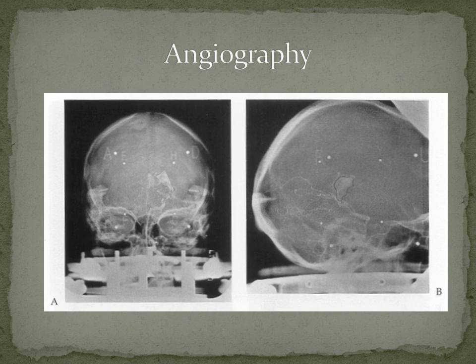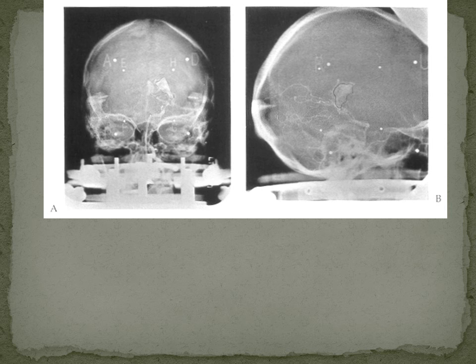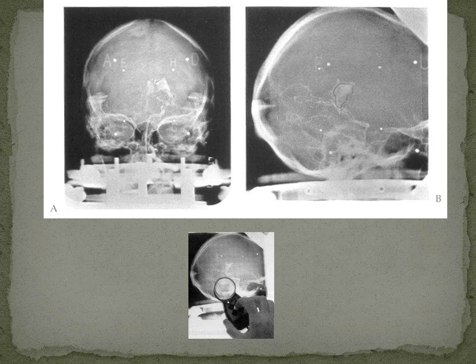And here's a picture of one of our first patients. And you can see the nidus of the AVM. And you can see the fiducial points. So based upon digitizing these fiducials and outlining the nidus, we can tell you where the center of this is and the center of this is, and it gives us the middle of the volume. Here's another view. And there's actually Dr. Friedman digitizing in those little spots.